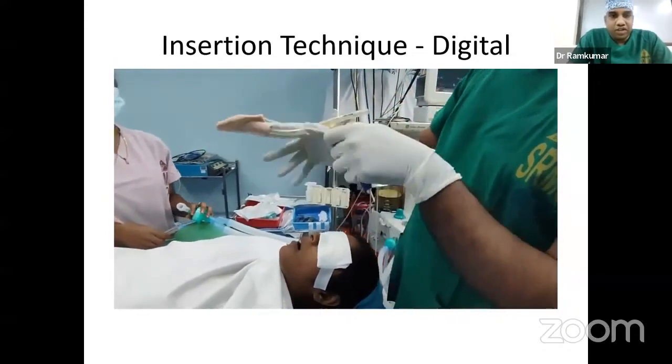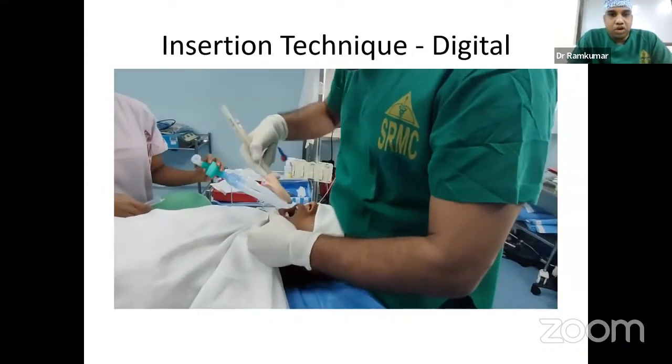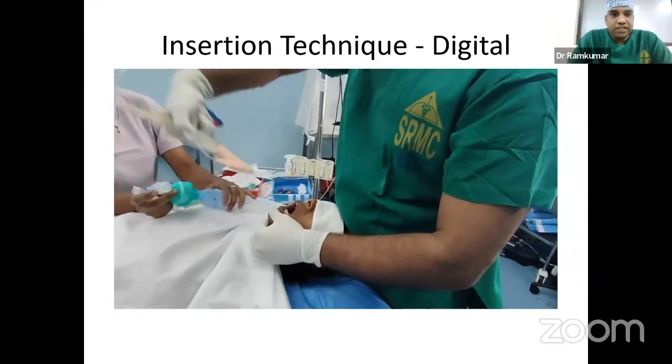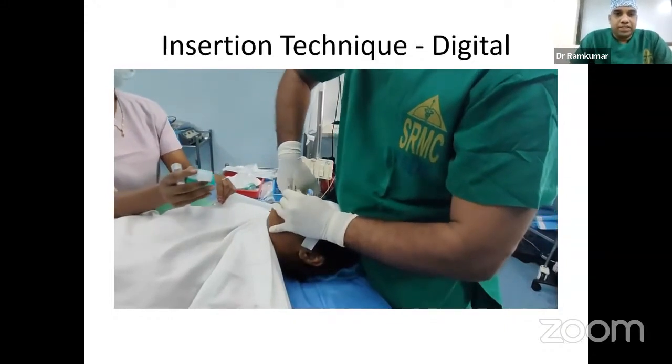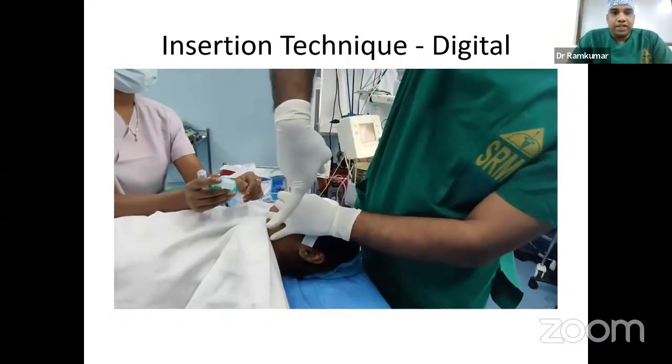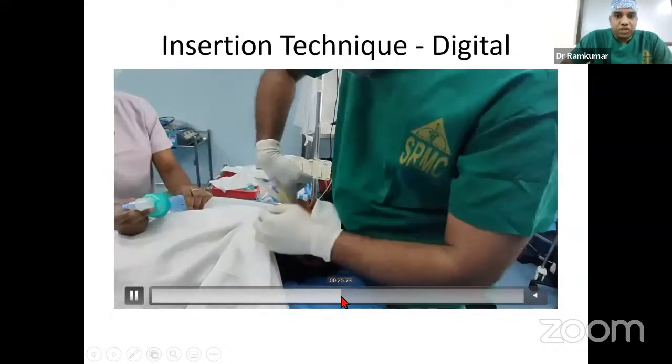They should be checked for a leak, and there shouldn't be any obstruction from clots or anything, because it's a reusable device. The device is held at the insertion tab and it is inserted along the palate. The idea is, so this is the movement. You should get a hyperextension at the interphalangeal joint. I'll show you once.